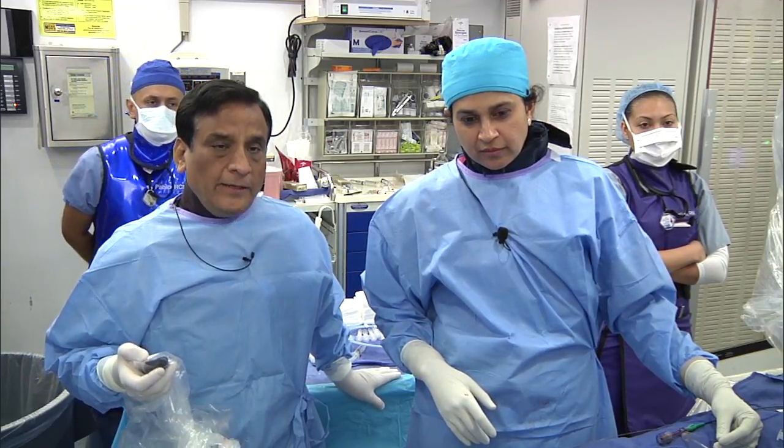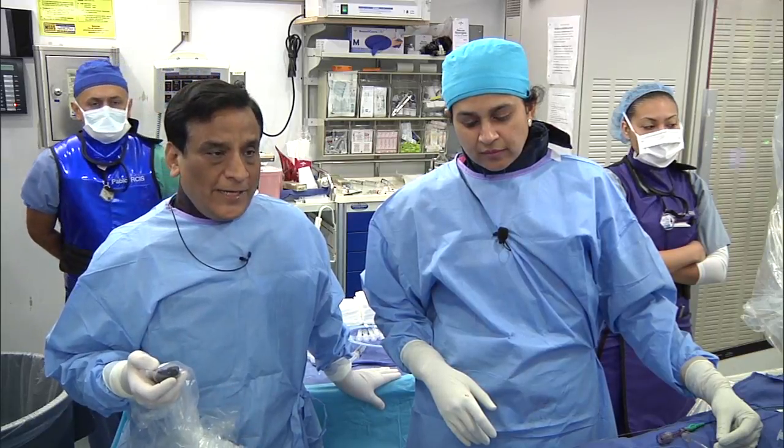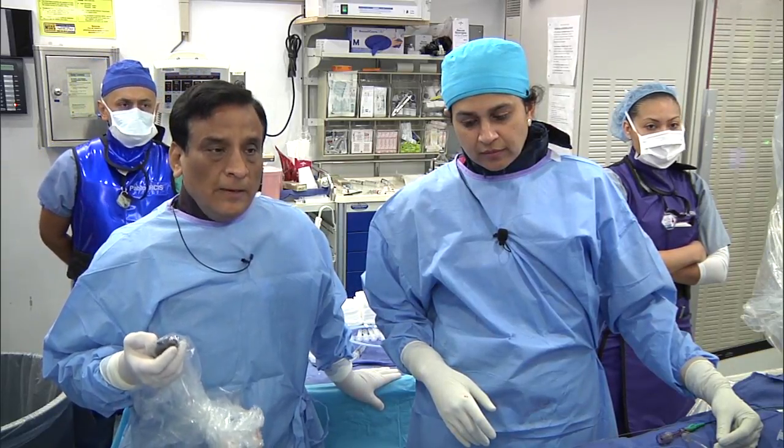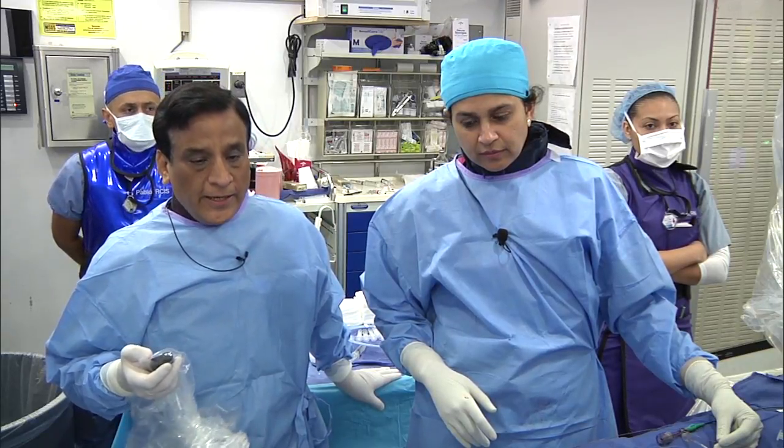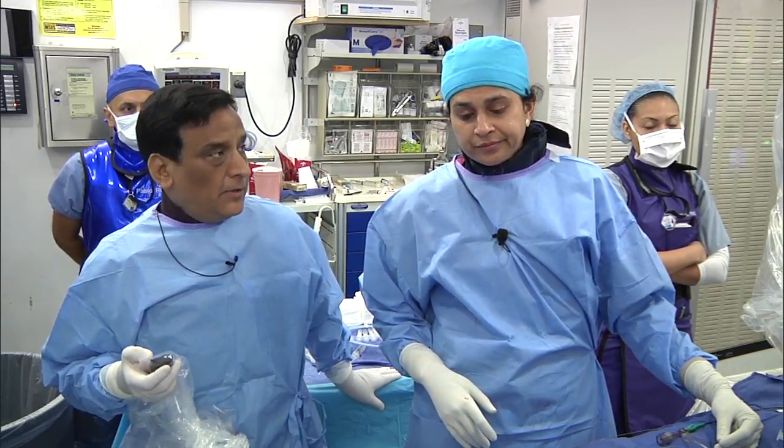Do a good antegrade, and of course, the antegrade will always have less dissection, less stent use, better results. And if we fail, then only you go. So in this day and age, maybe we can cut down this number to 50.